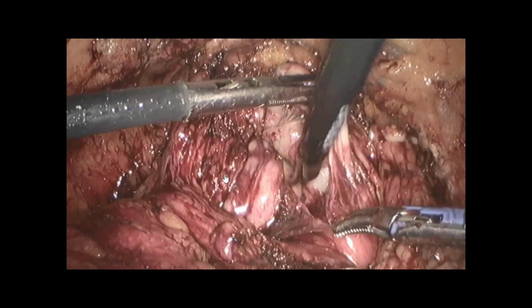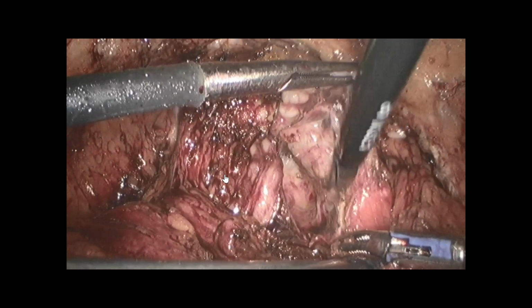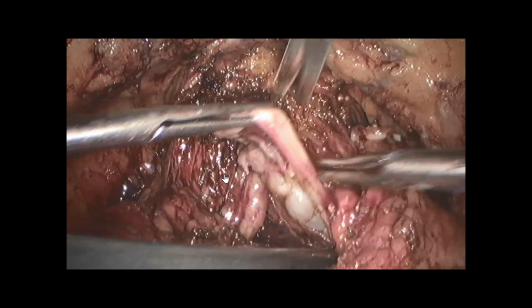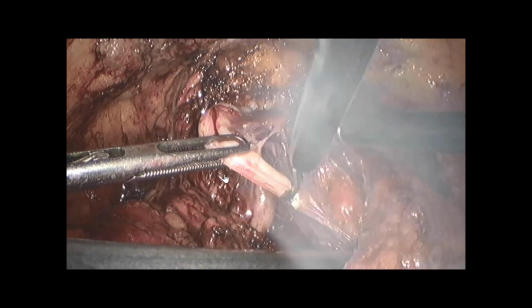Always you have the pedicle. The pedicle is always outside of the vas deferens, so you can do small coagulation. You have to cut the vas. You cut the vas. So this time is not a difficult time.